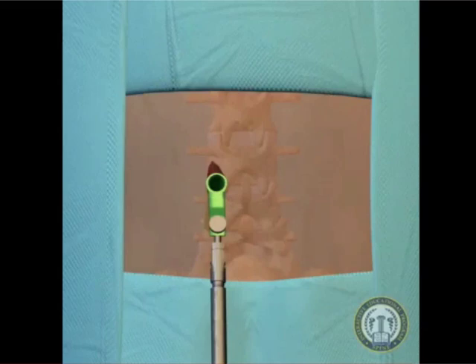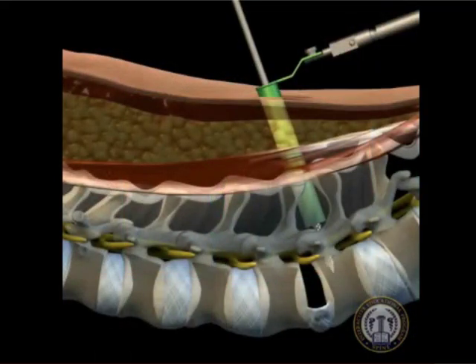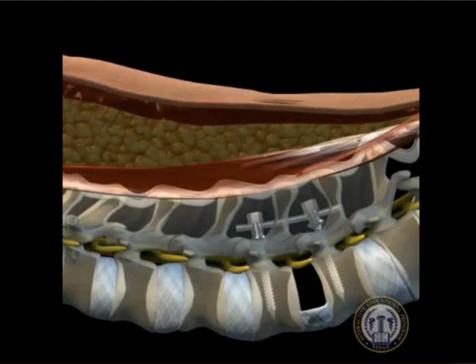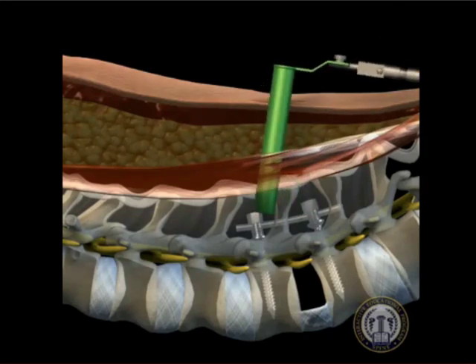Following the discectomy, the interspace may now be distracted by creating a mirror 2.5 cm skin incision on the contralateral side, centered over the interspace. Percutaneous pedicle screws are then placed, and a rod is sub-fascially levered into place. The contralateral screws are tightened to a distracted position in order to create optimal space for the interbody device. If there is concern about contralateral neural element compression, a direct decompression can be obtained by repositioning or wanding the ipsilateral tubular retractor, or by placing a second tubular retractor through the contralateral incision.